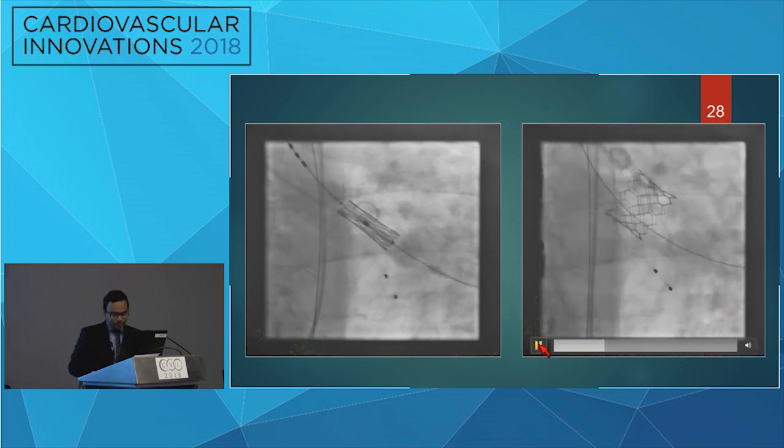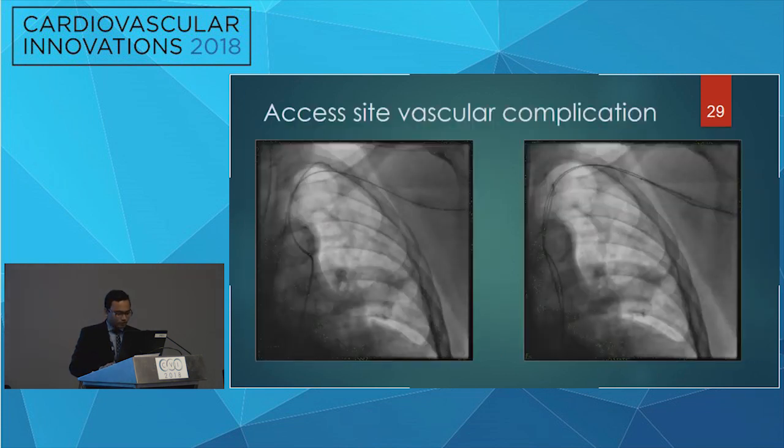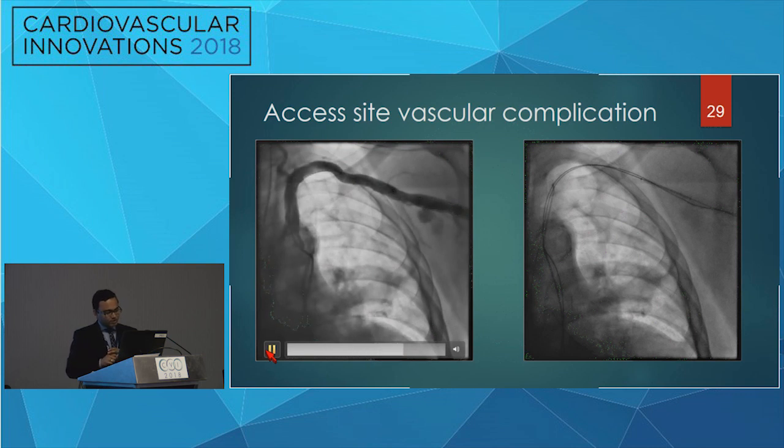I deployed the valve. It was 80-20, almost 90-10 or 80-20, I would say. Good implant under rapid pacing. No AI was noted on TE as well as the angiographic pictures that we got. I just wanted to open this and see what do you think of what we're dealing with here. Is it considered perforation? Could be an aneurysm.